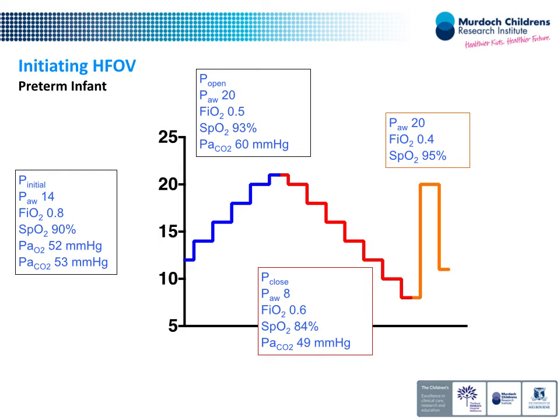So, definitely in the Netherlands, I would do it this way at this point in time. Is that so because you open, so then you can disperse the surfactant? That's a theoretical argument, that by opening the lung up, you are going to get better distribution of surfactant. There's also a clinical... But then you need to have a chest x-ray before to make sure your ETT is in a good position. Why?